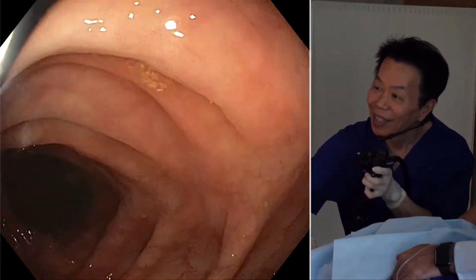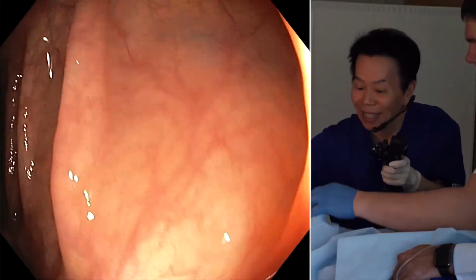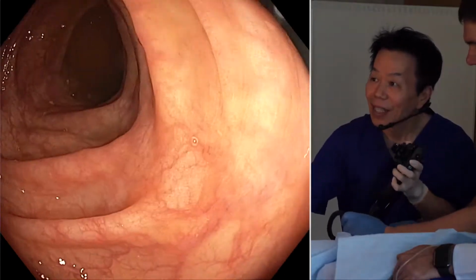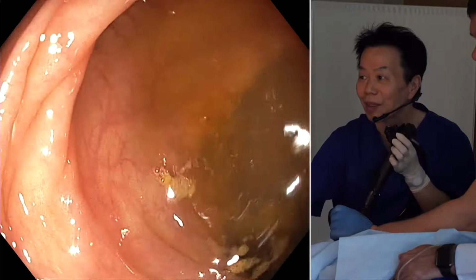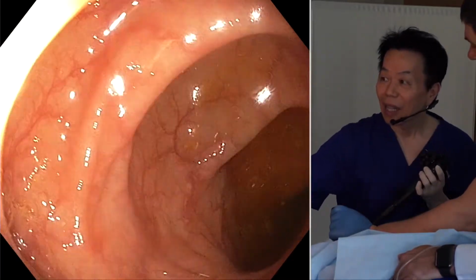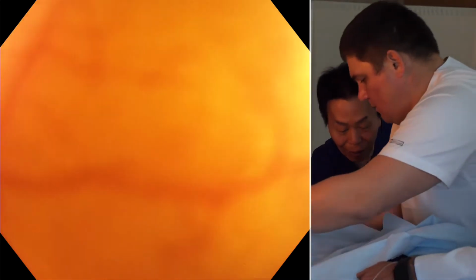No need for that. The scope is a little bit complicated now. So maybe I should turn the patient back to the supine position if I can do that. Now, maybe we are near to the hepatic flexure. So can you make it a supine position on her back? Yeah, that's right.